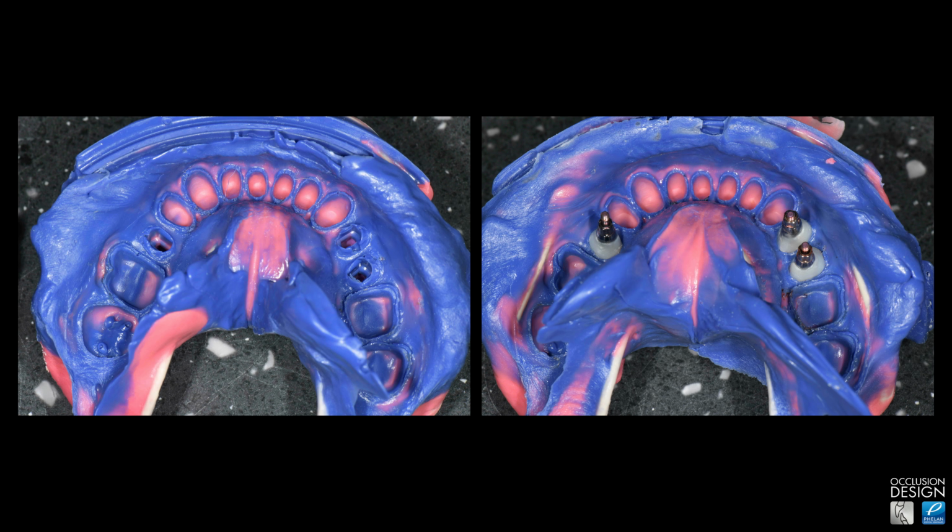And then you can see the impressions. I actually took two. I took the one with the custom impression transfers, open tray, and it was a tough impression. I had one little pull over here or area that wasn't perfect.